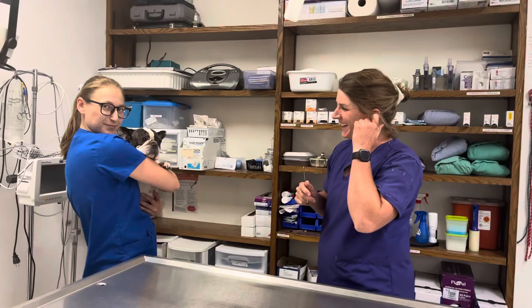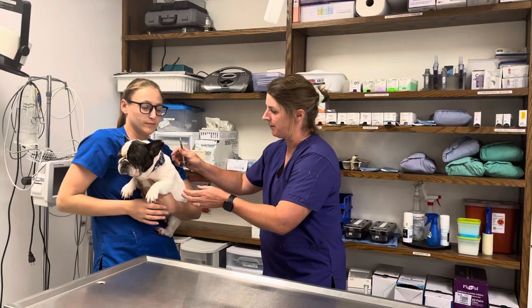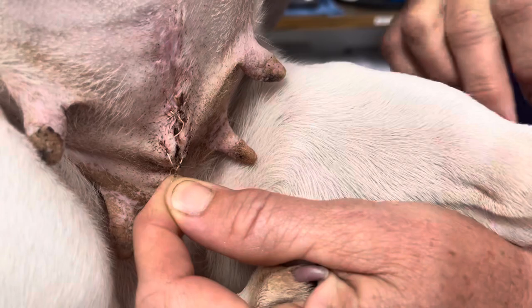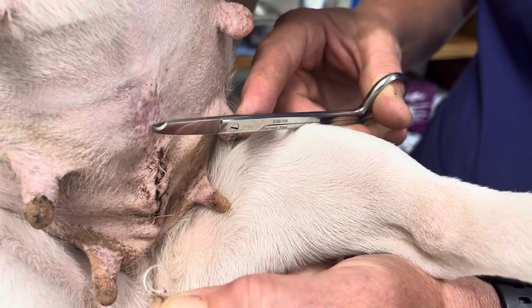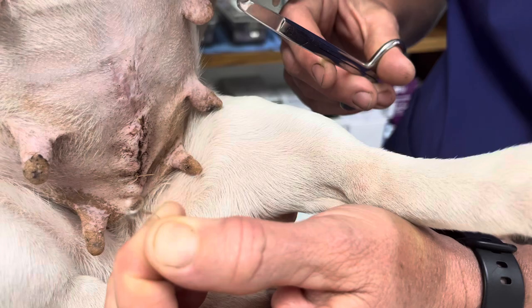This is Lola. Lola is a rescue French bulldog owned by one of our technicians — she was a breeding mama in her previous life, so she's got a funky undercarriage and she's got some cruciate stitches down low. We've got three of them. You see how when I pull on it we see our knot right there and then we see two sides — I only want to cut one side. I'm using suture scissors; the best thing to use at home is a toenail scissors or even a toenail trimmer. So one side, and pull — and that's what I mean by the curly Q. Second one: hold on to the string, cut one side, and pull it through for a curly Q.